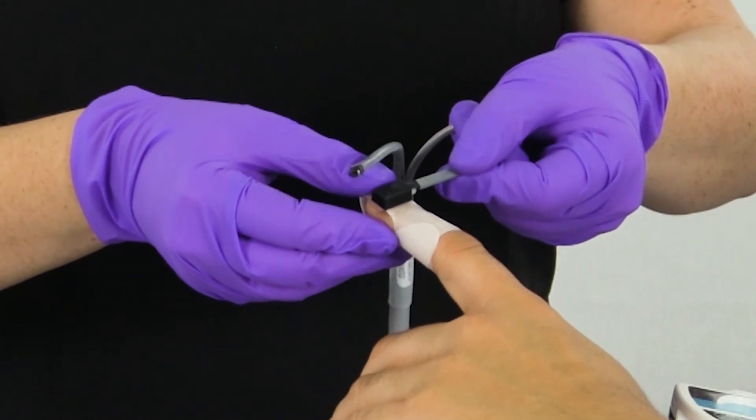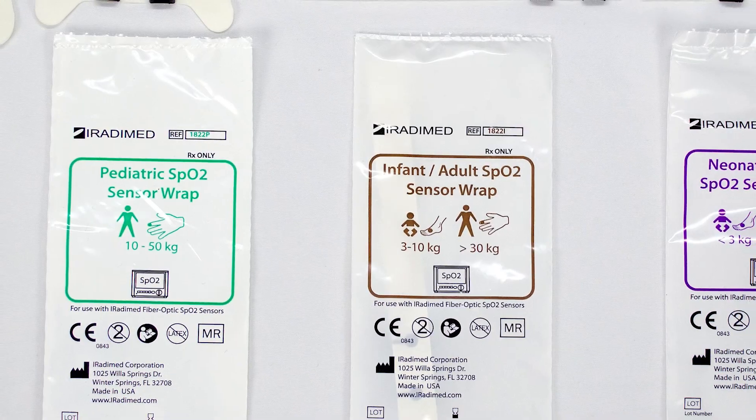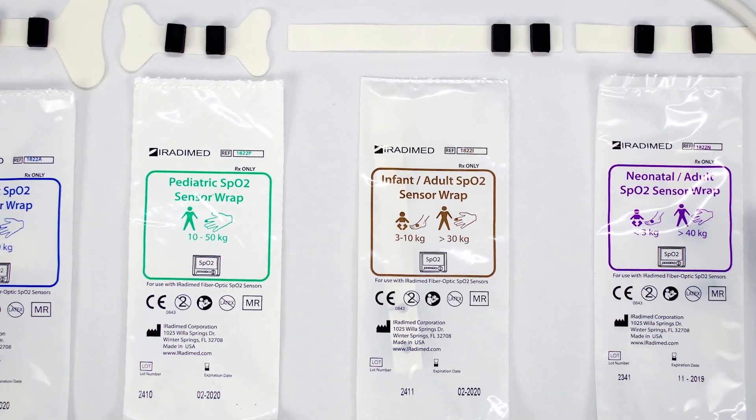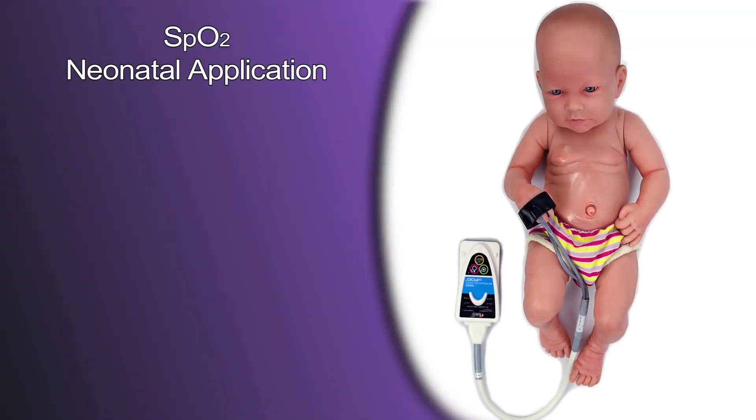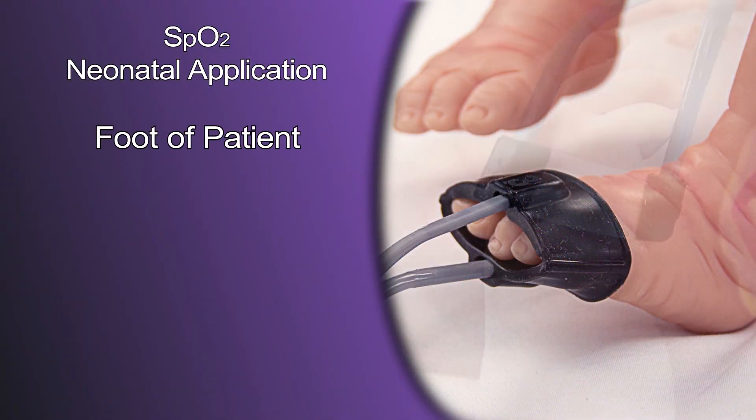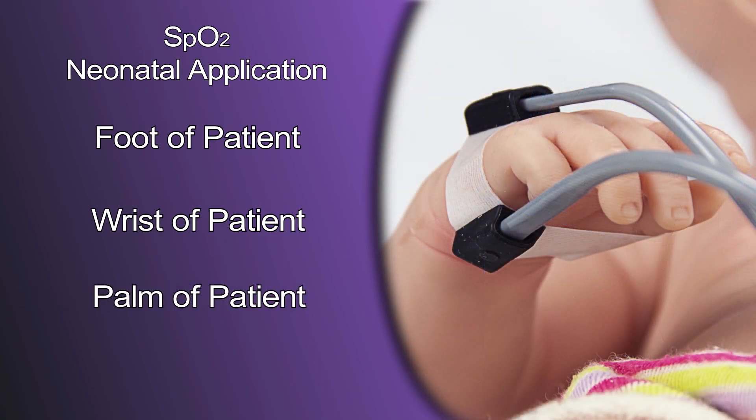Pull straight out and dispose of used grips accordingly. Iratomed's SpO2 grips can be placed on any finger or toe the user finds most appropriate. For neonatal patients, the user may also choose the foot, wrist, or palm of the patient.